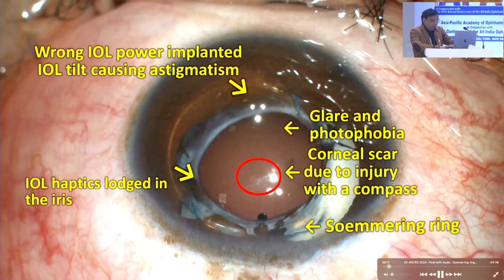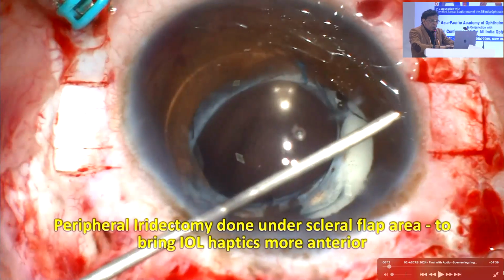Now let's look at this patient here. Somebody had implanted a lens, there was a PC rupture, and the lens was left behind. Years later, the patient has come to me. This guy was a big shot in the garment business. You can see the lens is subluxed, Soemmering rings are present. So I told him, no problem, I'll make you all right. Whenever I tell a patient like this, I'll make him all right, you can imagine how bad it will go.